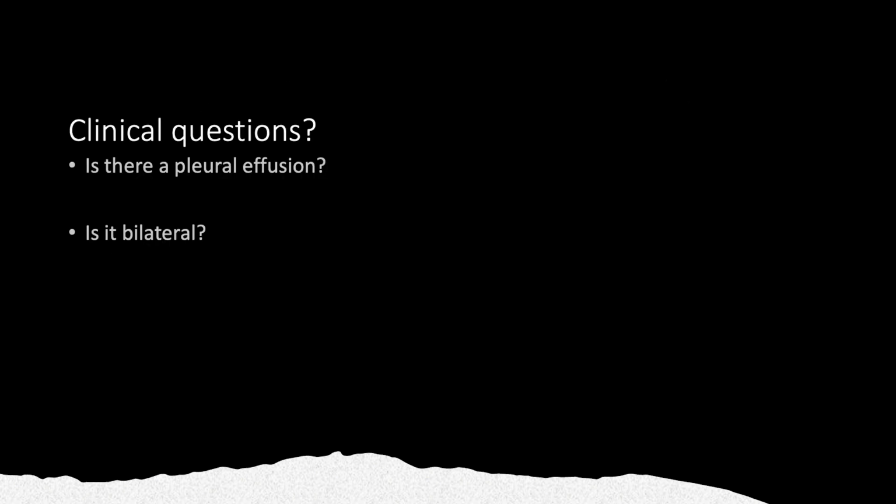So here I'm using focused ultrasound to answer some questions for me. I guess my questions were, is there pleural effusion and is it bilateral? And the answer is yes for both of those questions.